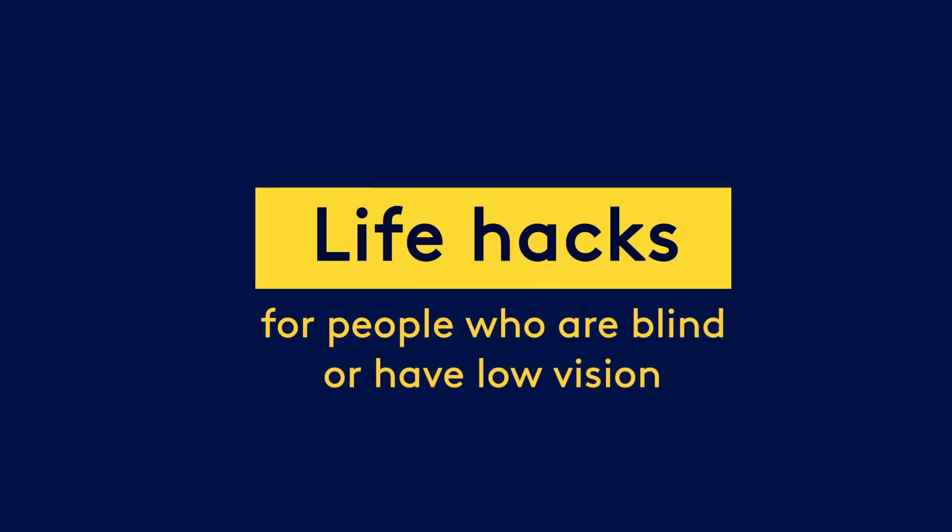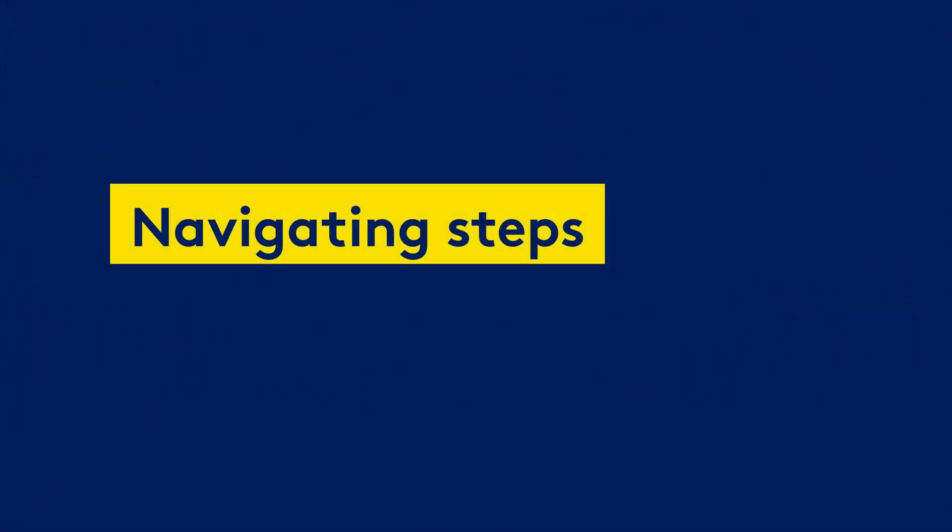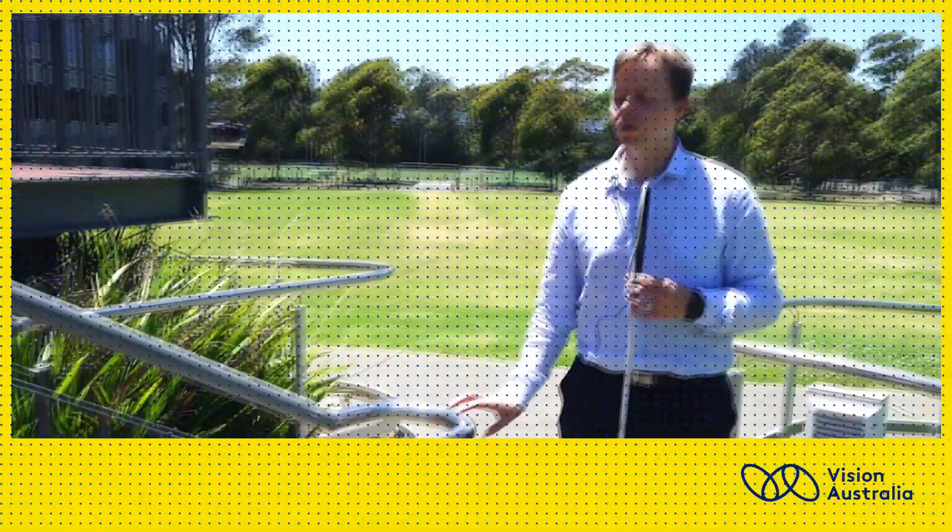Life hacks for people who are blind or have low vision. Navigating steps. John Clower, Vision Australia. With a white cane in hand, John stands at the foot of a flight of external stairs.